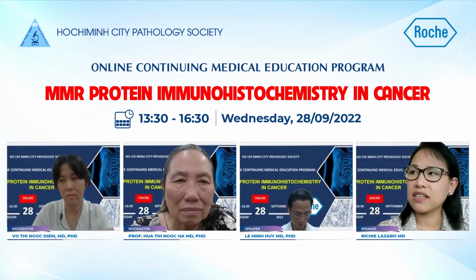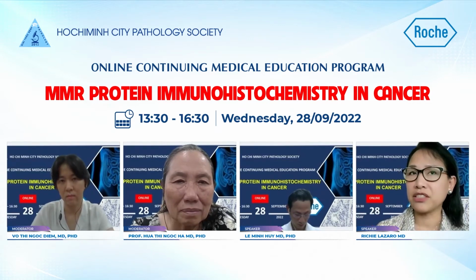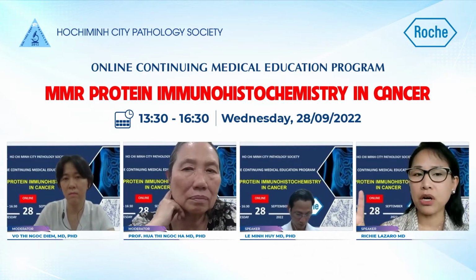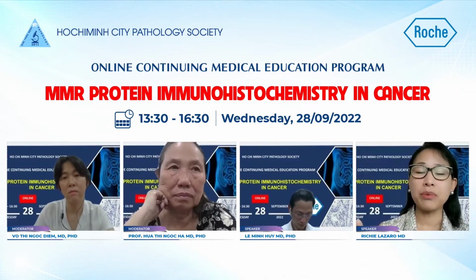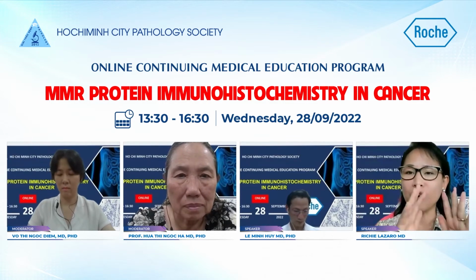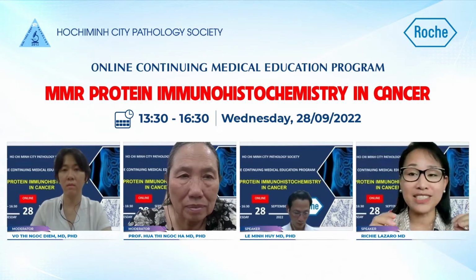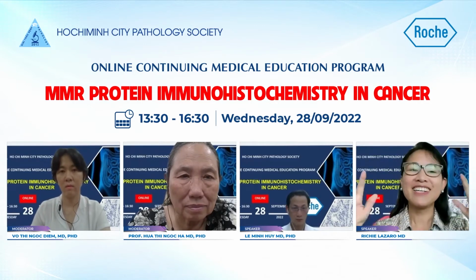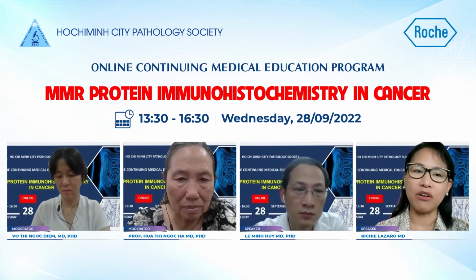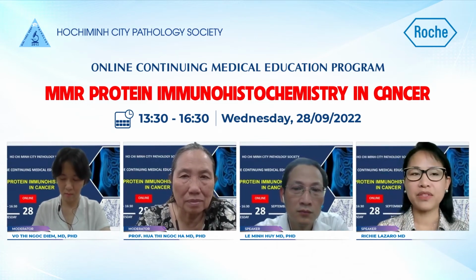Or they can discuss what to prioritize, right? But one way potentially would probably be to, instead of using the 4 antibodies, select only the 2, because if you notice, MLH1 and PMS2 always become abnormal together, and MSH2 and MSH6 almost always become abnormal together. So you can select maybe just 2 out of the 4 in cases of limited tissue, like only MLH1 and MSH2, for example, as a priority.